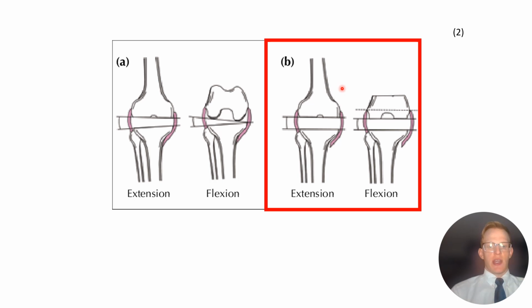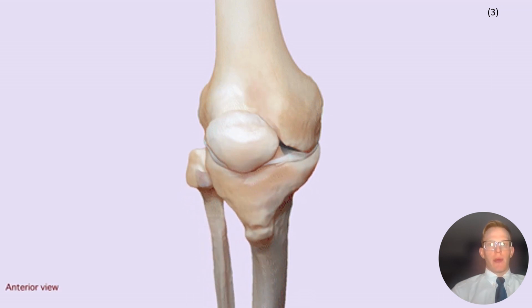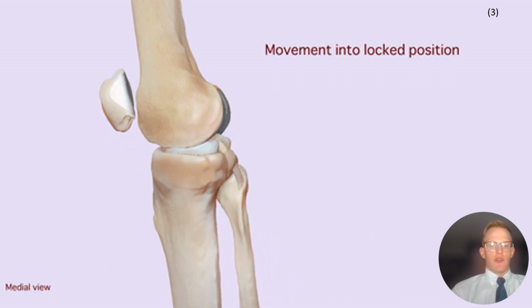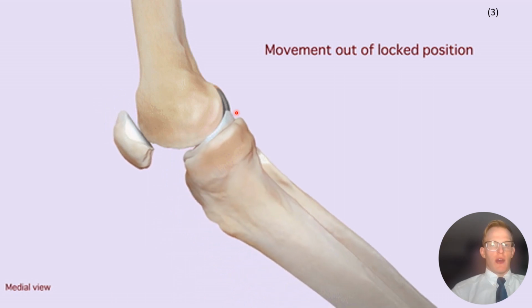The representation at the right of the screen demonstrates post-cut rectangular gaps for a hinge-based model of the knee. However, native knee gaps are not necessarily rectangular. Additionally, the unscrewing mechanism is critical for proper articular alignment during flexion, indicating that it is not purely a hinge movement. The lateral compartment is more mobile around a medial pivot point.